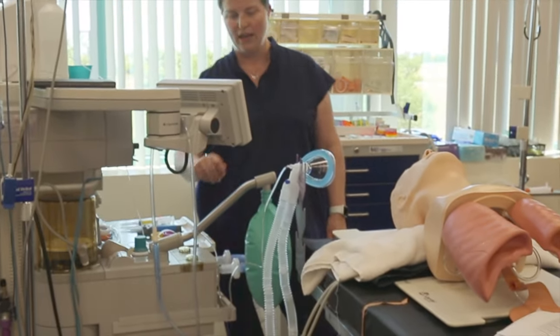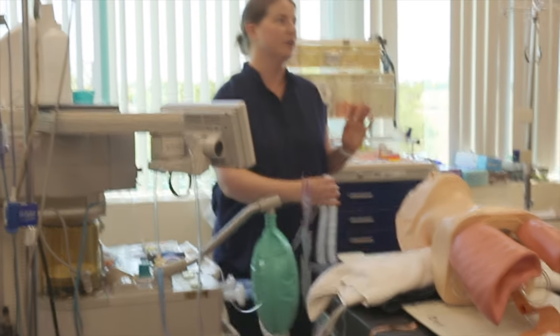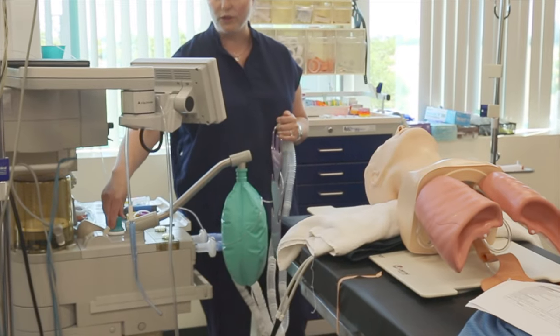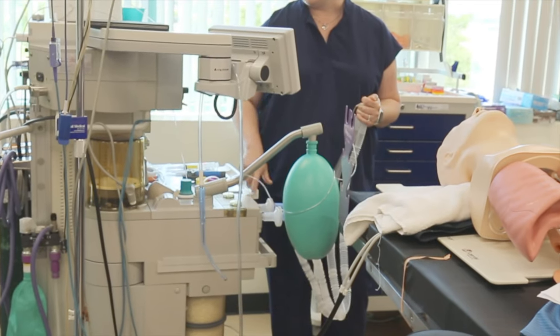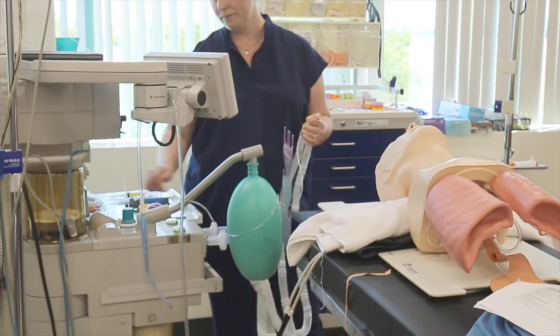Vaporizers are off, and then you want to make sure that you can pump pressure. Every time you put a new circuit on the machine, you need to test the circuit to ensure that you can hold positive pressure. So just like you did for your machine check, you're going to close your APL to 30, and you're going to inflate your reservoir bag until you hit a pressure of 30, and then you're just going to make sure that you can hold pressure.